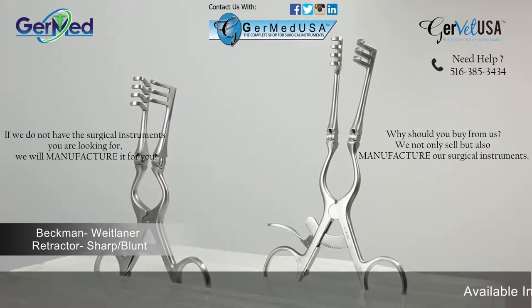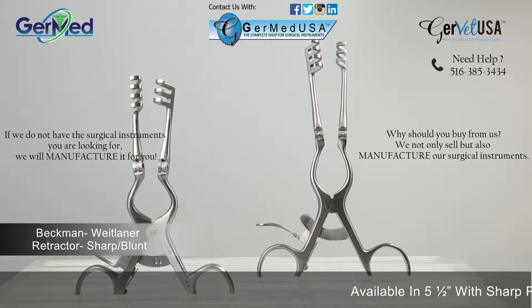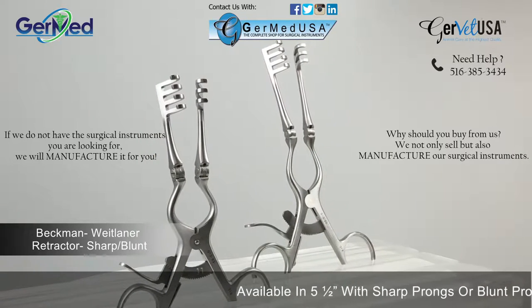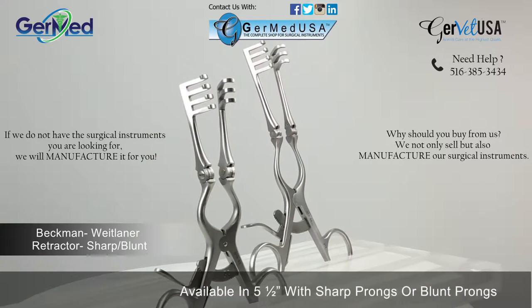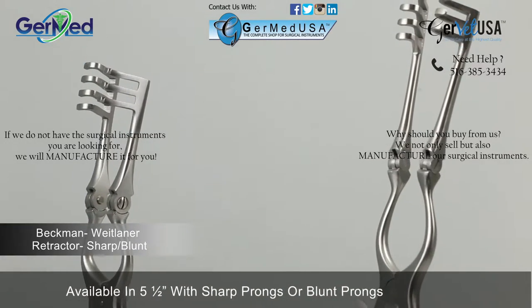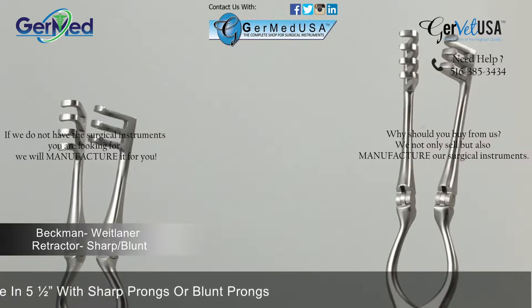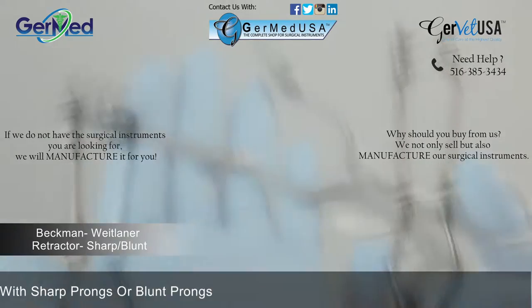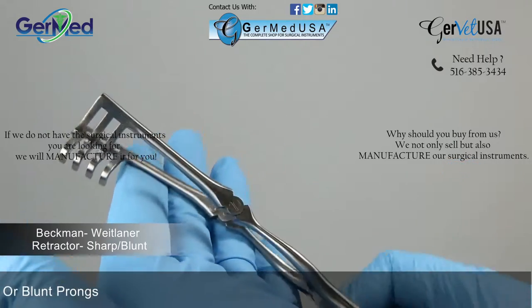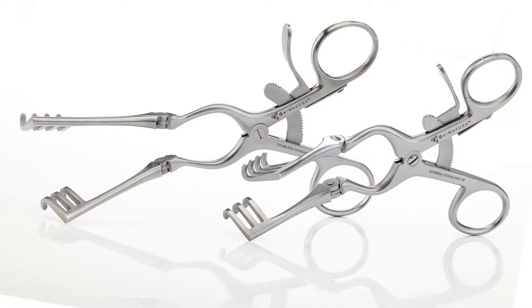GermEd provides a Beckman Wheatlander retractor with the size of five and a half inches. Beckman Wheatlander retractors are a self-retaining instrument used in procedures to hold back tissue based on location or shape of surgical sites. They are often used in small surgeries. The retractor features a hinged blade and either sharp or blunt prongs in order to accommodate both tough and delicate tissue.